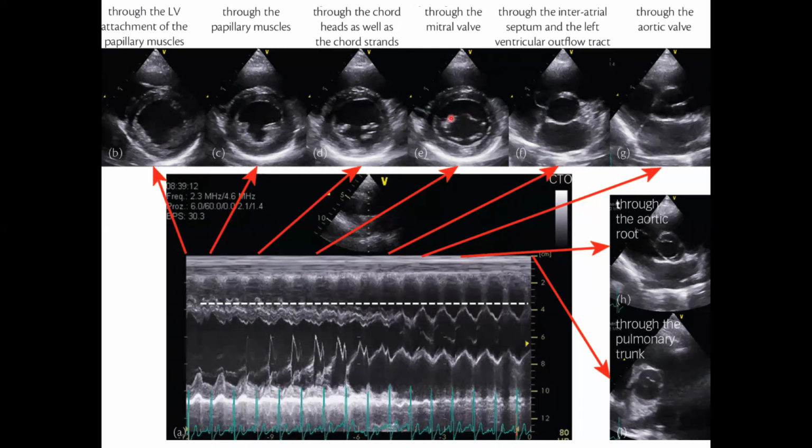And then it starts to intersect things like the mitral valve right here, and the aortic outflow tract here, and the left atrium here. So we're just tilting up over time. You can imagine while you're doing that, these things are beating along, and you're seeing what's going on, right?